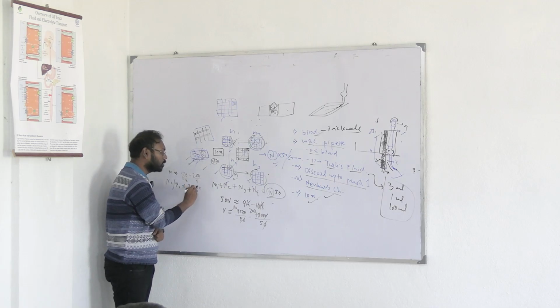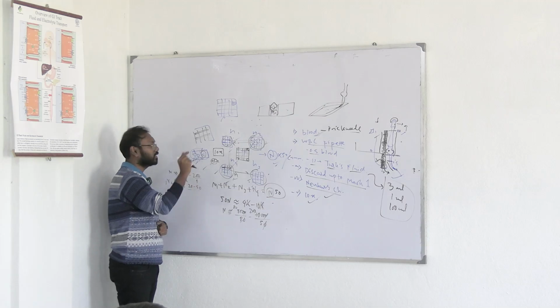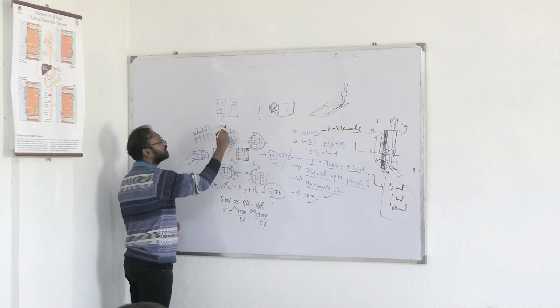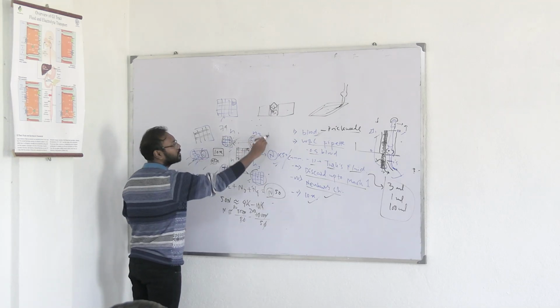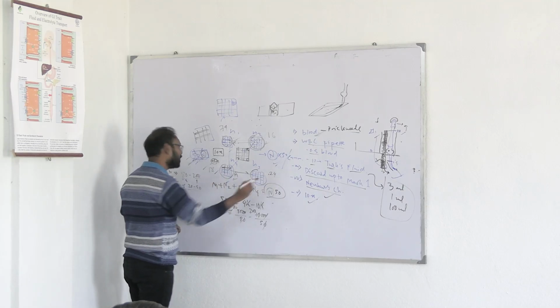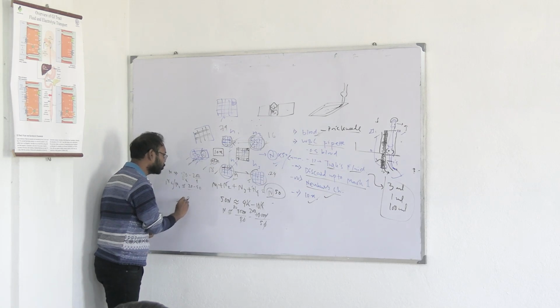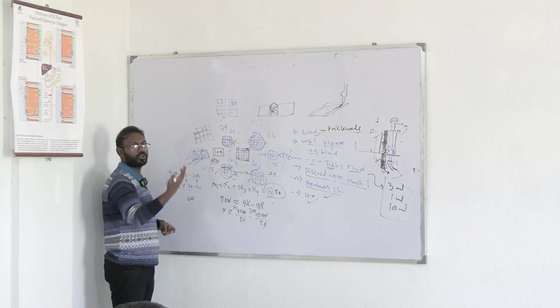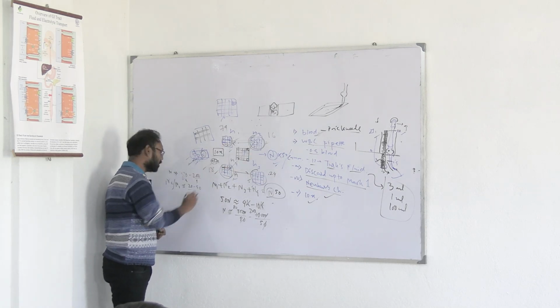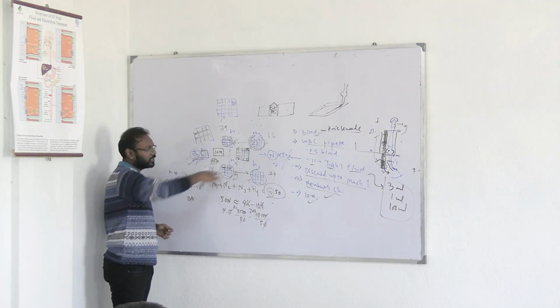20 to 50. Now তুমি বলতেই পারো স্যার 20 to 50 মধ্যে থাকতেই হবে না, তার কোনো মানে নেই, this will be the average, ওকে. সাপোজ এখানে তোমার 74 এলো, then এখানে 16 এলো, এখানে 18 এলো, এখানে 24 এলো, এরকমও আসতে পারে, but it will be around. যদি তোমার এখানে ধরো 200 চলে আসছে, then you have to cross check, তুমি অবশ্যই চারটে করবে, but if this is 200, okay, that means probably there is any infection present, that's why WBC বেড়ে গেছে.